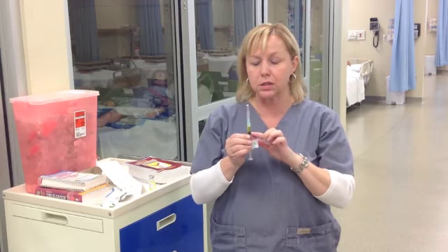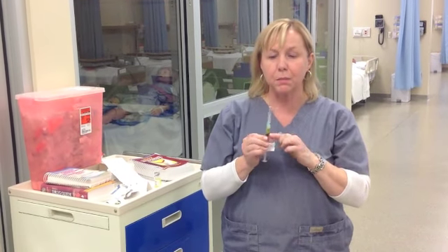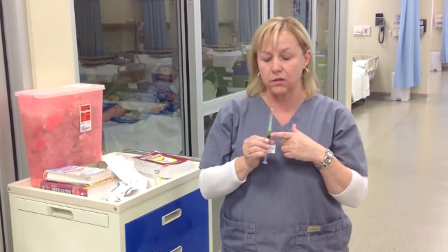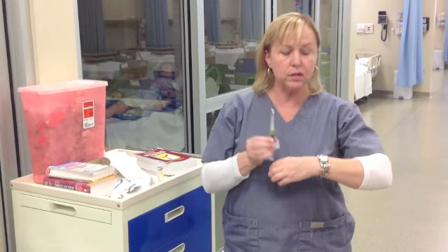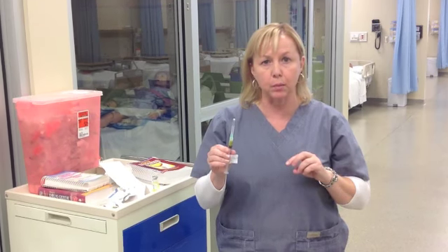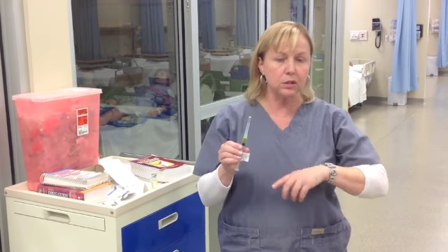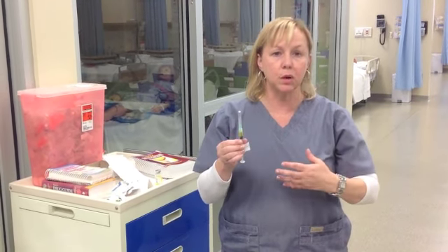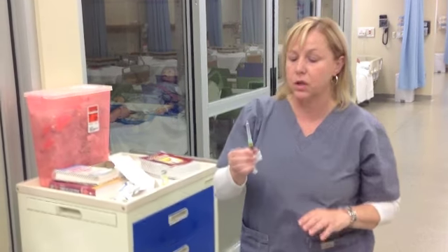So if I'm going to push a cc over 1 minute, that means I'm going to push about 2/10 every 12 seconds. And if I do that every 12 seconds and watch my watch as I'm doing it, that will mean that I will give that whole cc over an entire minute. So you push about 0.2, wait about 15 seconds, push about 0.2, wait about 15 seconds, and push about 0.2. So that should come out to be about a minute.